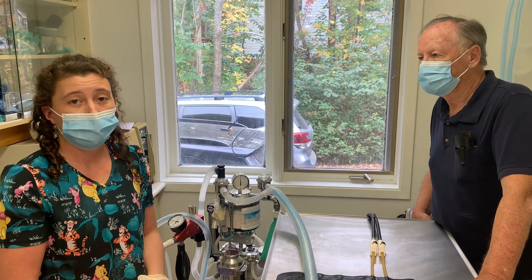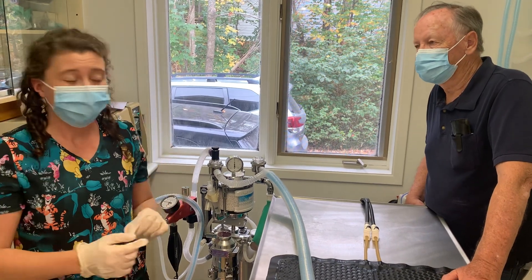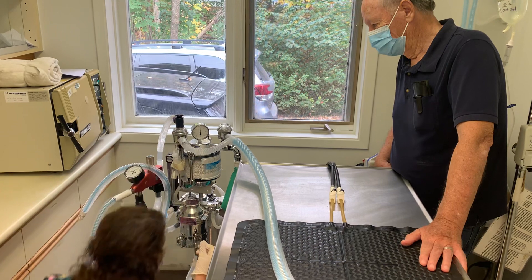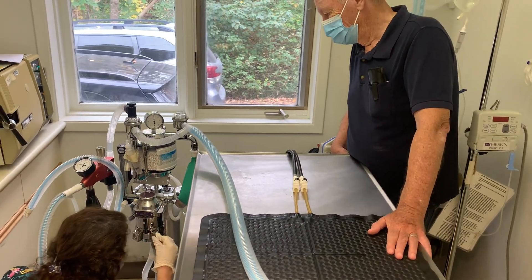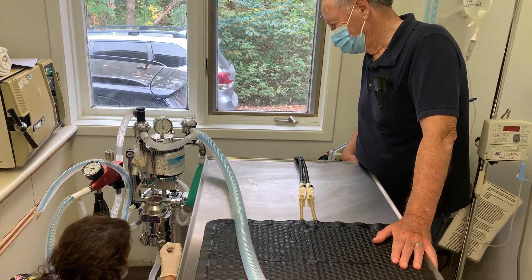I'm going to be filling up our isoflurane today. I want to make sure I have our key out — this is the key for our isoflurane. The key can come in and out here; it just goes in like this and then can come up, so it just sits in there but I can remove it out of the machine.